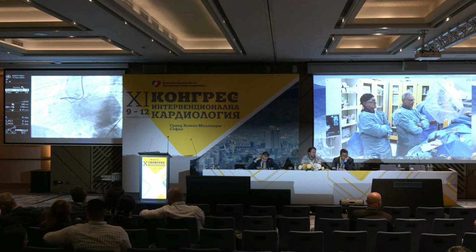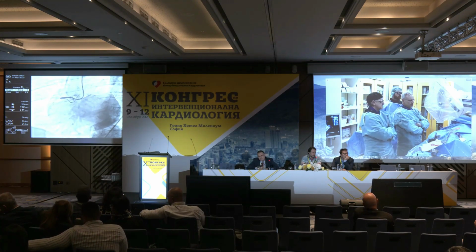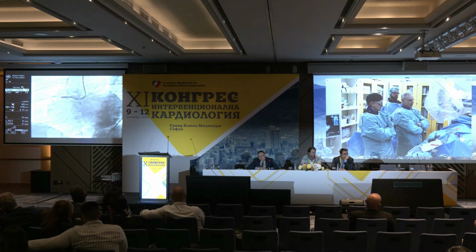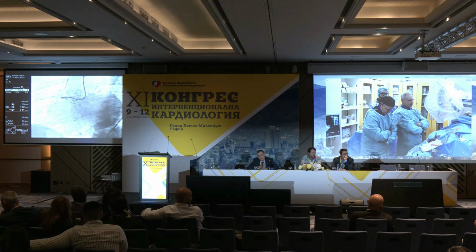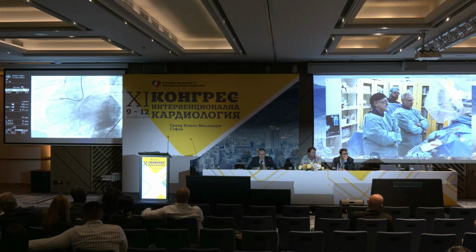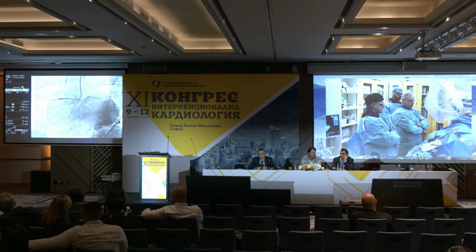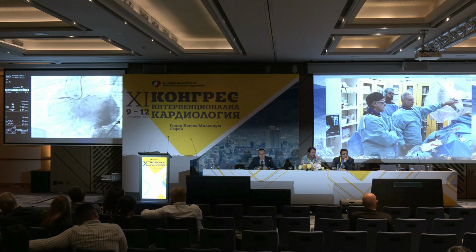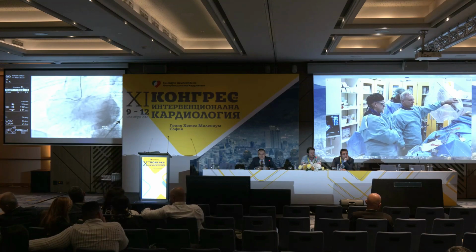If we don't see anything, zero, then we will know that this is not communicating with the pericardium. So managing complications is far more complex than doing the CTO procedure per se, as you can imagine. And see how much nice discussion it has triggered. Nothing. There is nothing.